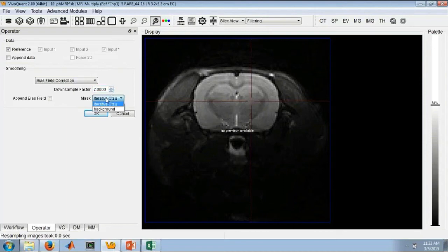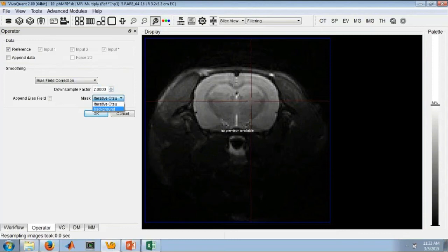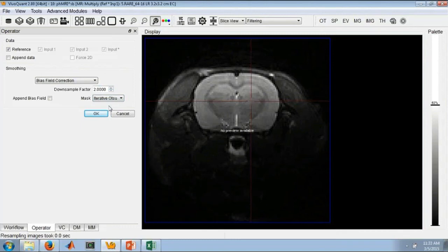In terms of the mask, right now the options are iterative OTSU and background. You can include a mask of any region of interest drawn in the 3D ROI tool. For instance, if we drew a region of just the brain, we could use that and only calculate our bias field within that region. The iterative OTSU uses a foreground from background separation technique repeated multiple times in iteration to determine on its own where the bright values are within the image and correct for them that way.